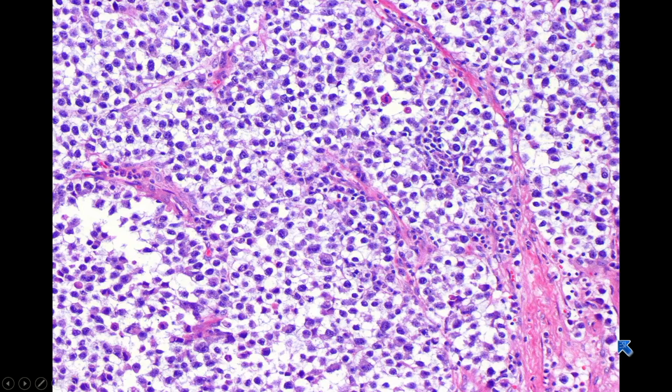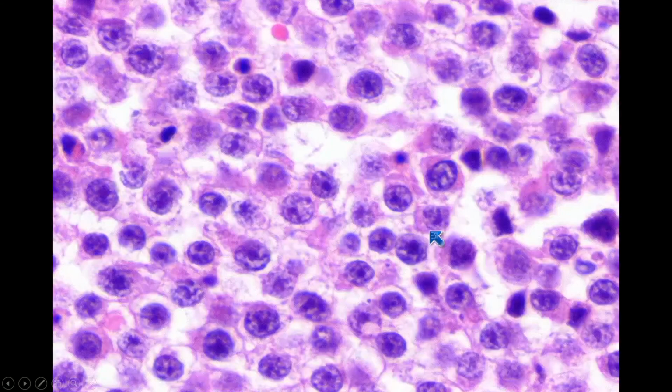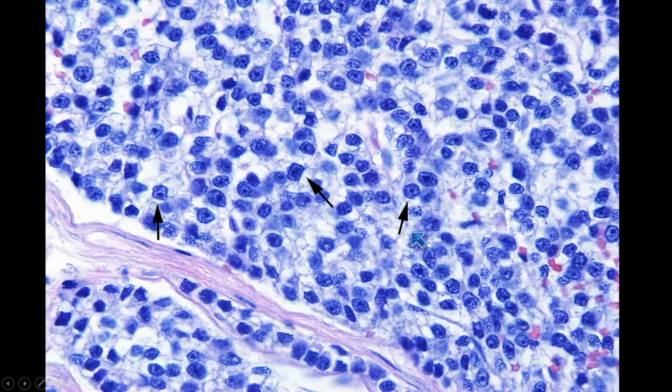In the typical seminoma, usually it's pretty straightforward: clear cytoplasm, lymphocytic infiltrate, loosely cohesive cells, nice central nucleoli, fairly uniform cytology, not tons of mitotic figures. So again, usually not a problem. Some of the features you also see with seminomas, not all of them, but some of them will have almost a little boxy, squared off shape to them, which is typical of seminoma as well.